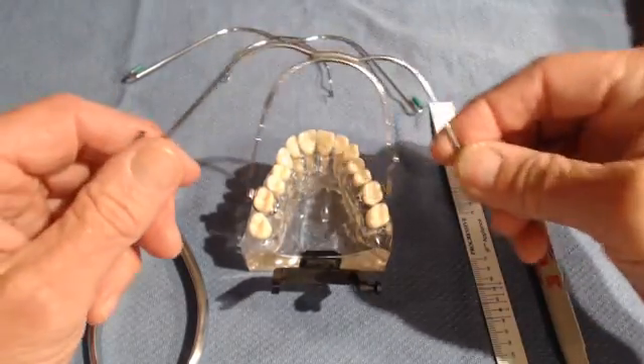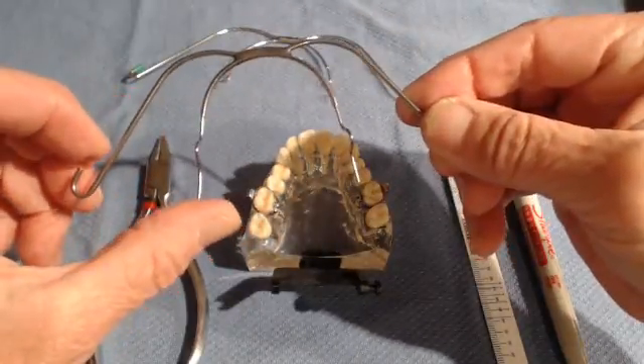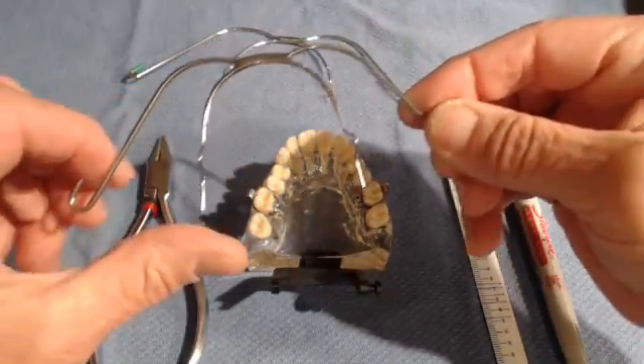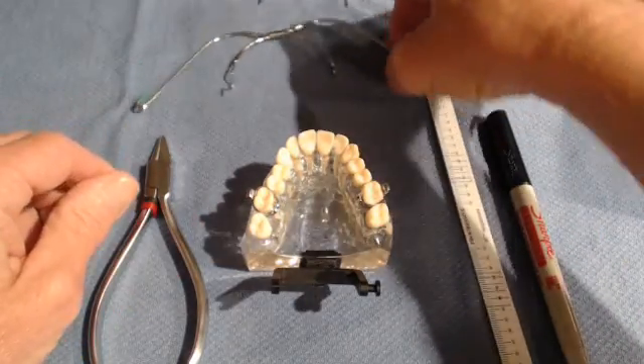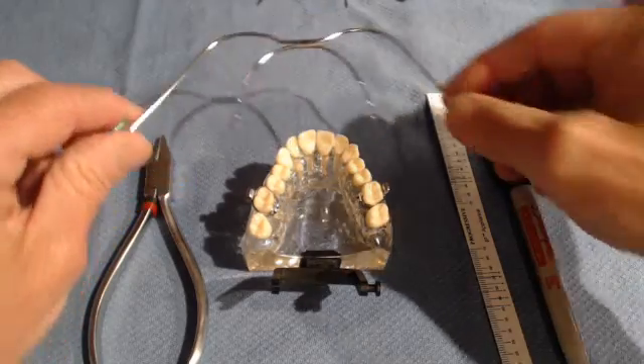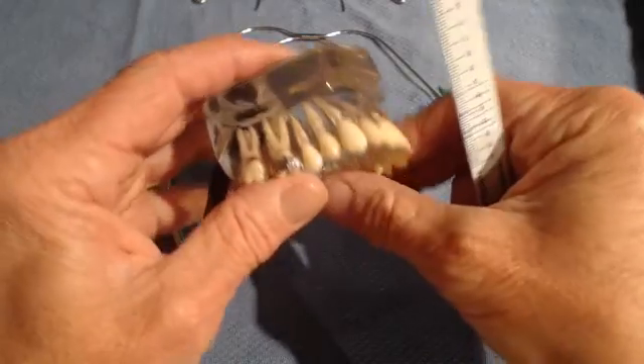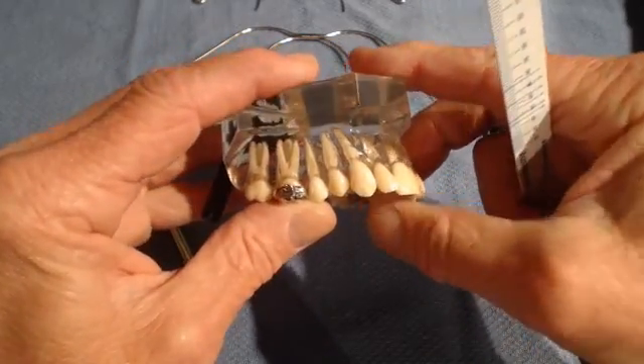This is the bow for a high pull. You know the difference because with a high pull, the inner bow is about the same length as the outer bow. In a cervical headgear, the inner bow is much shorter than the outer bow. The next step is to determine the size of the bow that you need, which you will order from Progressive Dental Supply.